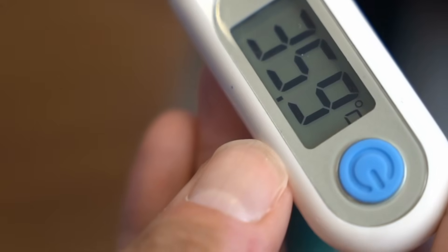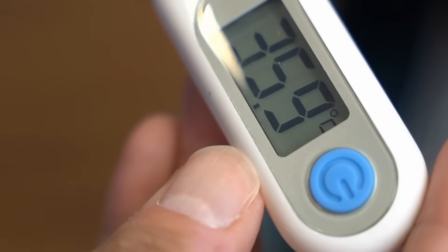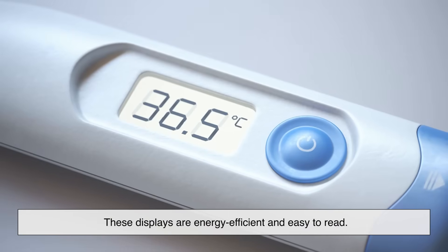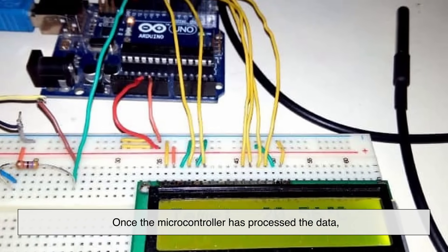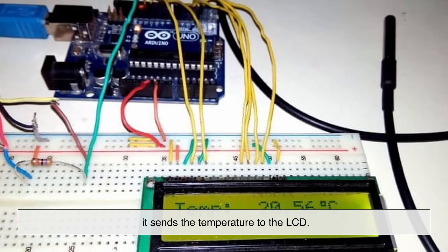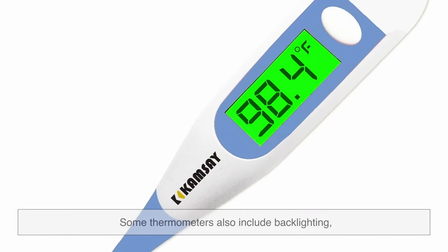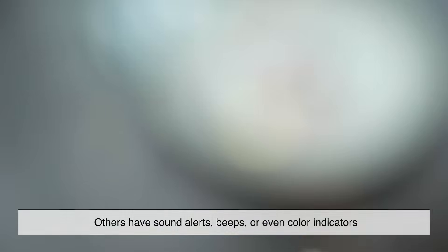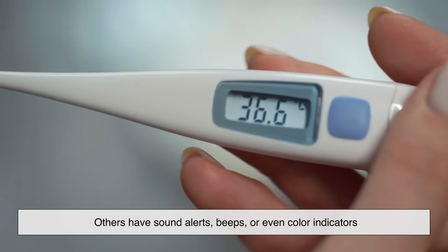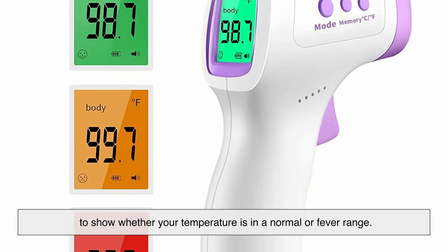Most digital thermometers use a liquid crystal display, or LCD, to show the temperature. These displays are energy efficient and easy to read. Once the microcontroller has processed the data, it sends the temperature to the LCD, and there you have it — your reading. Some thermometers also include backlighting, making it easier to read in low-light conditions. Others have sound alerts, beeps, or even color indicators to show whether your temperature is in a normal or fever range.